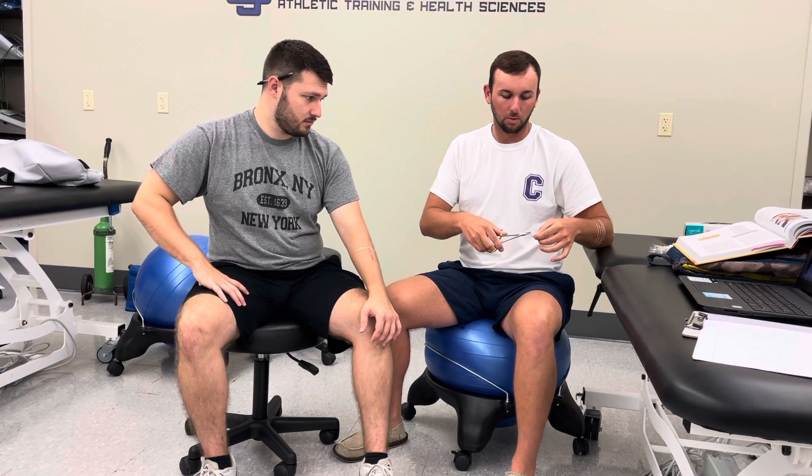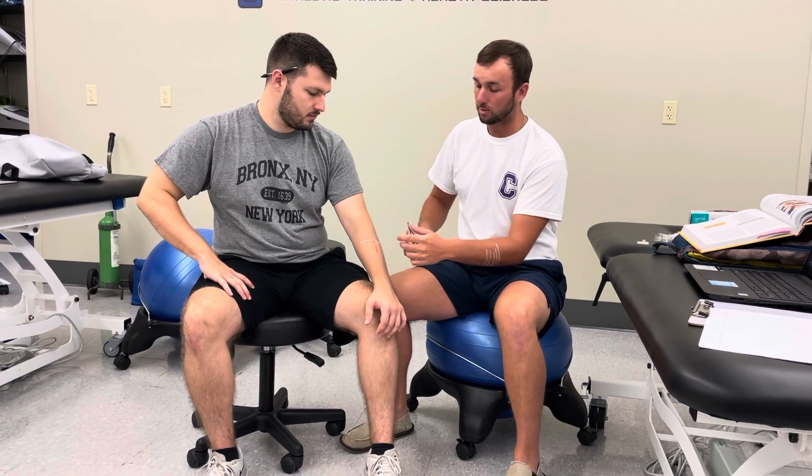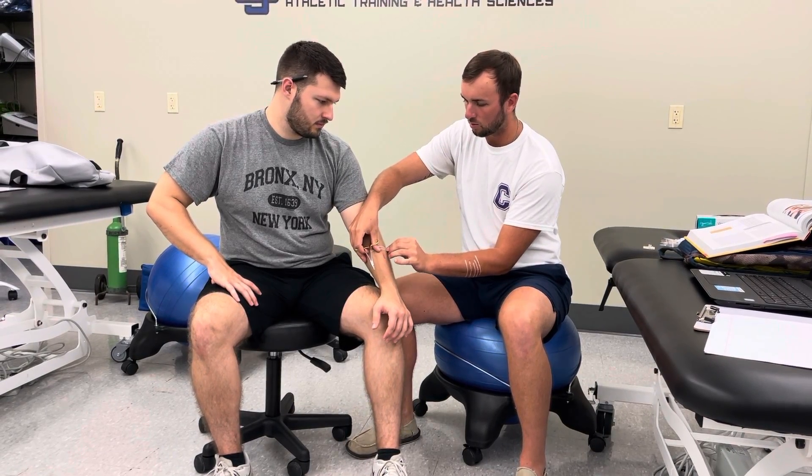For the next strip, I'm going to do the same thing, except I'm going to put my anchor strip down here first. Criss-crossing — I just pull it across. And then I'm going to continue to do that until the wound gets closed up.